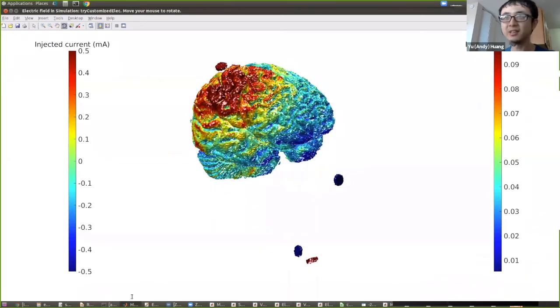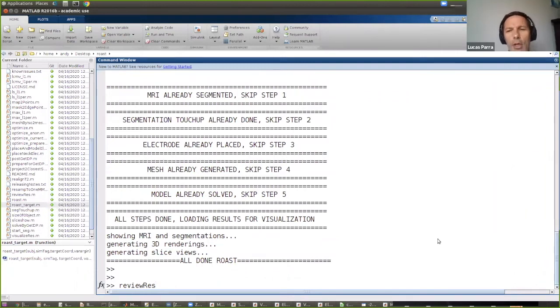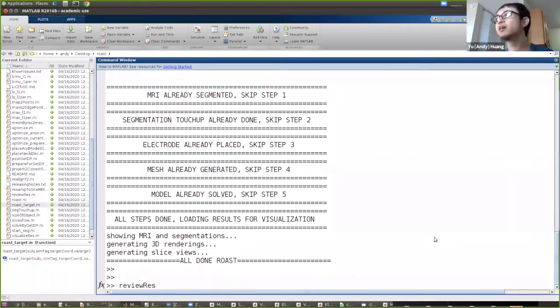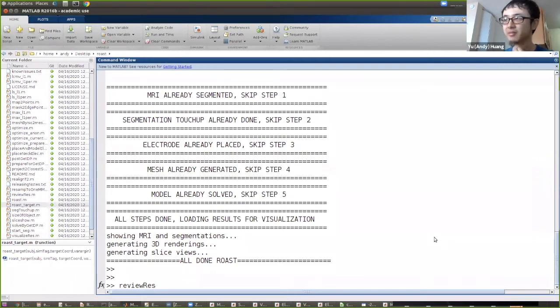Now I'll show the review ROAST function. This function is for reviewing results after simulation. On the AC versus DC question: in ROAST, everything is treated as DC. As mentioned, AC below one kilohertz is quasi-static, so the simulation is the same as DC. You don't have to specify any frequency because there is no frequency in ROAST — everything is DC.